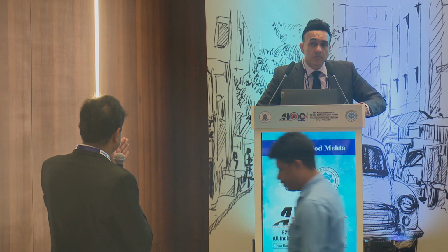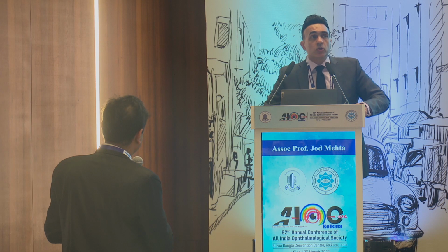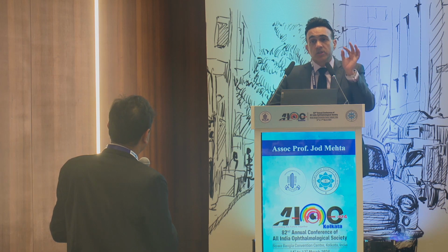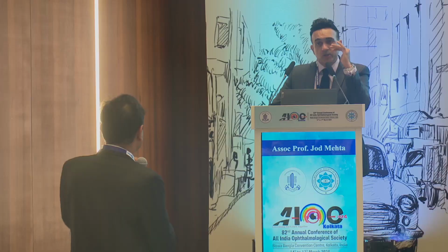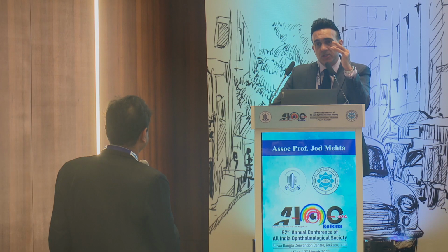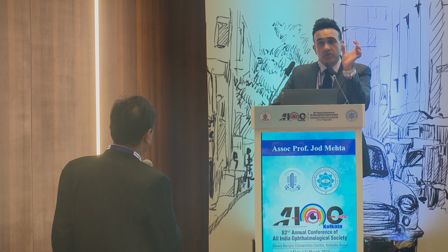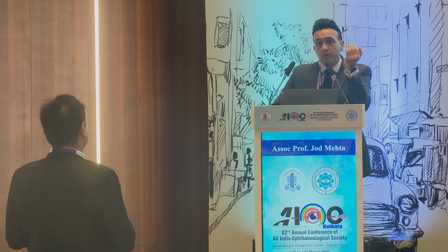So I was just asking, once you lift the flap, how much is the target ablation that you're doing on the undersurface of the flap? So what I do is I measure it on the OCT. Remember, the flaps were basically created with about 150. So I do basically between about 40 to 50 microns, and then I use the OCT at about 5.5 millimeters when I do the ablation on the flap itself. And you get some quite decent improvement on that.